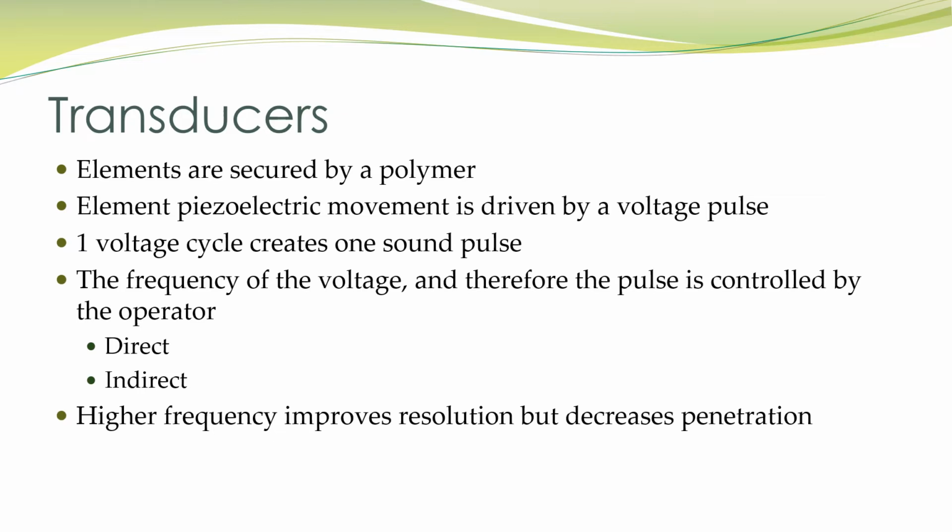Now, each of those elements is secured to one another to hold their form with a polymer in between. That polymer will fill in the matrix and give a nice stable component to the transducer face. Each element, as I mentioned before, is driven by its own voltage pulse. So if this was one particular element, here's another one, and we know they're arranged in a matrix. If I were to look at each element microscopically, we would see that each one of them has its own electrical channel. Through that electrical channel, it receives its voltage input, causing it to make its piezoelectric reaction to produce sound. And then when sound returns, we'd have that reversal where sound causes the piezoelectric interaction, producing a voltage.